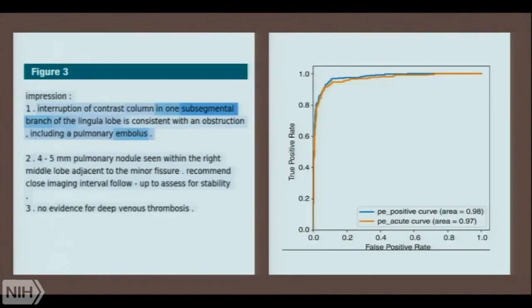So here's a figure from our paper in Radiology. When we talked, again, as Brad mentioned, we were going to show some visualization examples. So this is a relatively shallow CNN. We used pre-trained word vectors and GloVe embeddings to create a classifier that can pull positive PE from free text CTA reports. And you can see, we didn't do any word level annotation, by the way, for the training data. This is all document level. And yet the CNN model was able to identify the words that you would expect it to in order to come up with the diagnosis of PE.